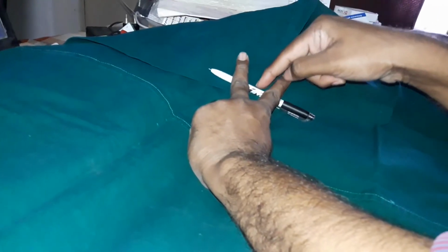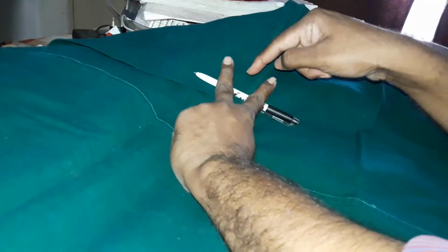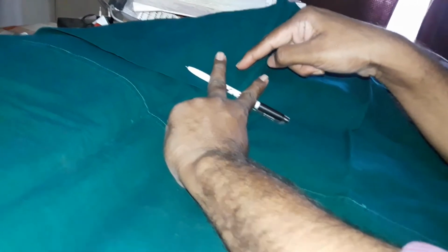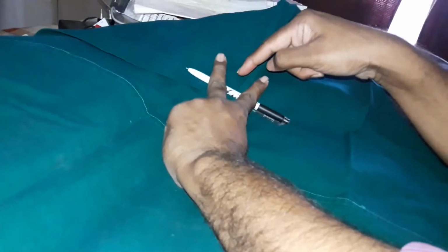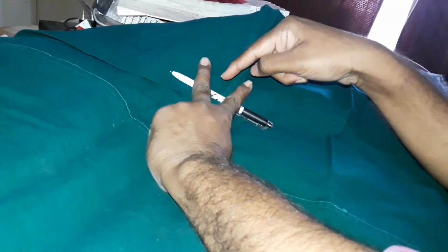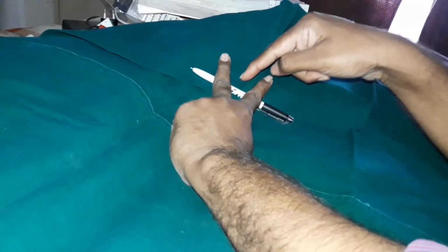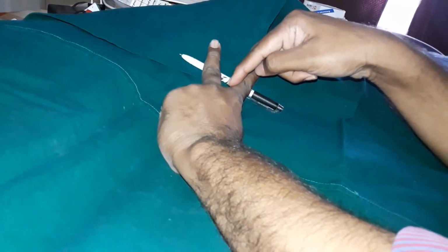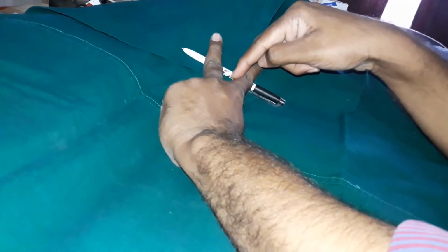You may not concentrate on the facial nerve here. So when you are coming below from the sentinel cell, once you have viewed the incudostapedial joint and are trying to locate the round window, you are so focused on identifying the round window that you may not notice injury to the facial nerve.